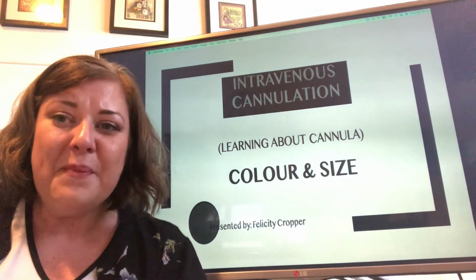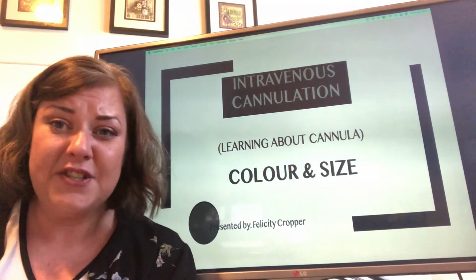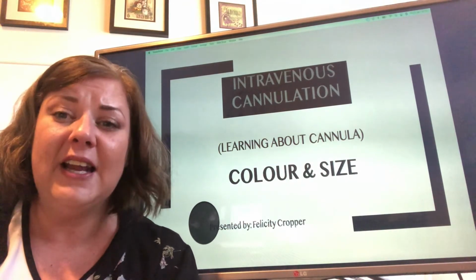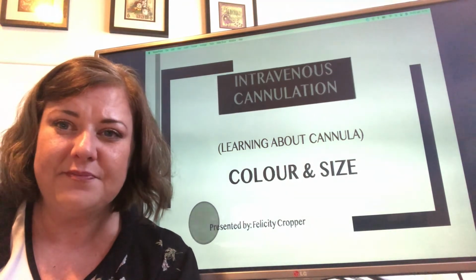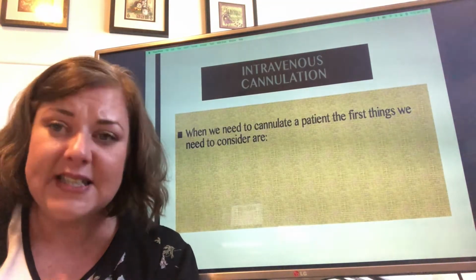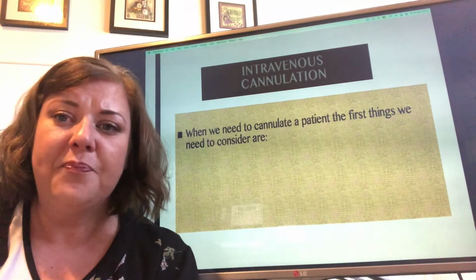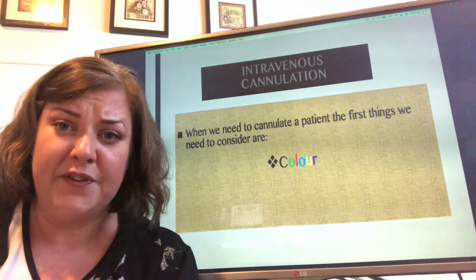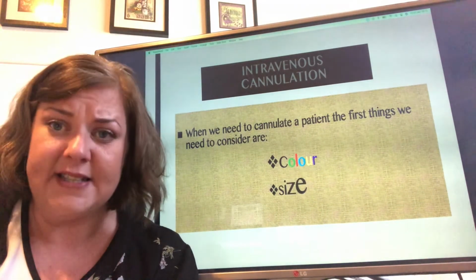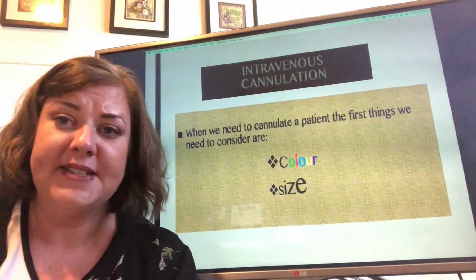Hi there, my name is Felicity, and today I'm here to talk to you about intravenous cannulation and learning about cannula colour and size. Now, when we need to cannulate a patient, there's a couple of things we really need to think about. The first one is the colour of the cannula, and identifying what size the cannula is that we're going to use.